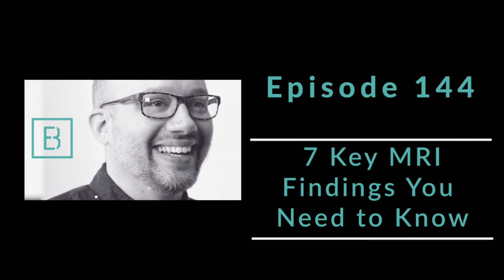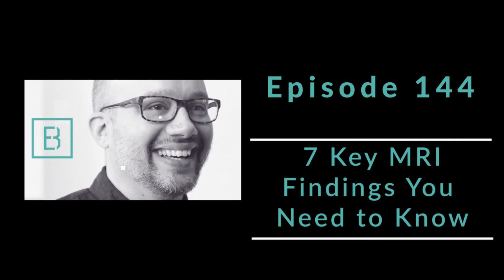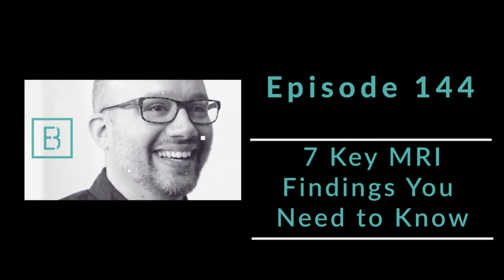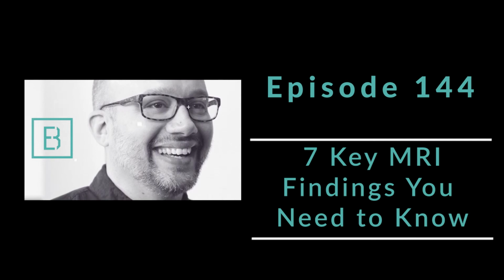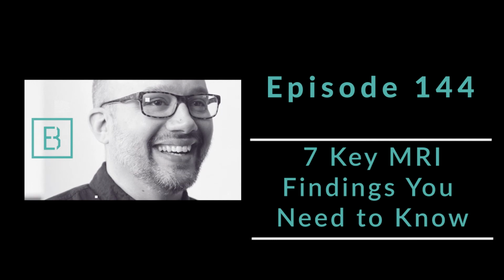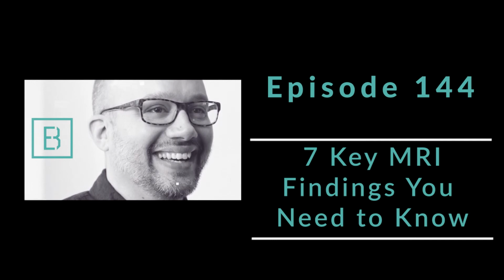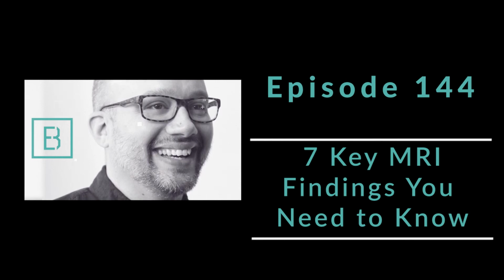These are the key items. The more of these that you see on somebody's image, the higher the correlation it's going to be between that and pain. And this just makes sense when we frame it that way, right? If there's a degenerative disc, it's lost its signal, it's a dark disc. If there's disc extension beyond the interspace, the nucleus pulposus shape is all out of whack.